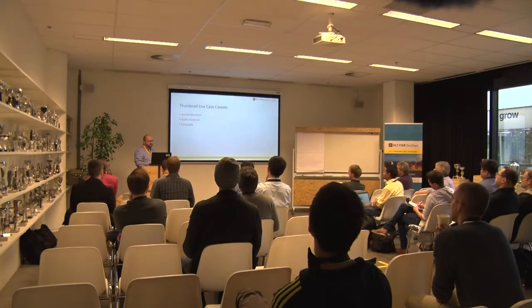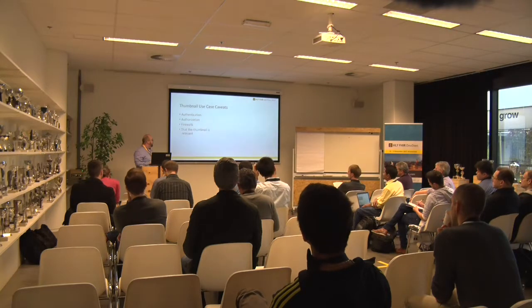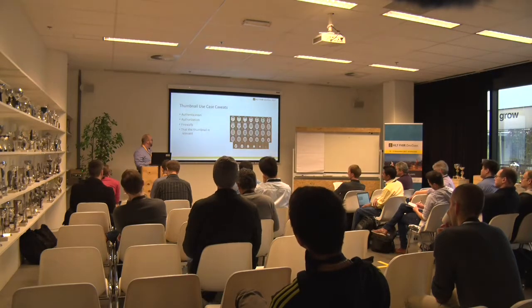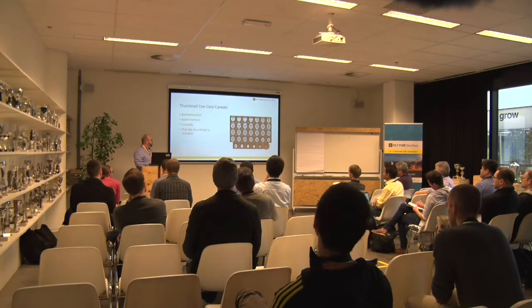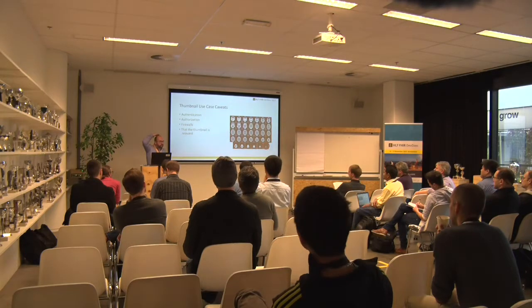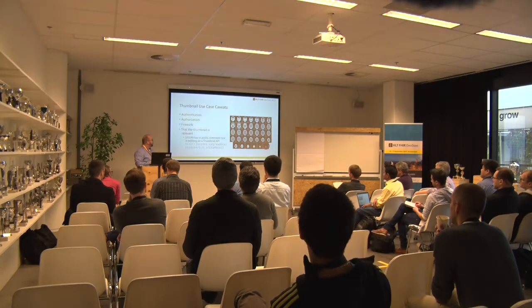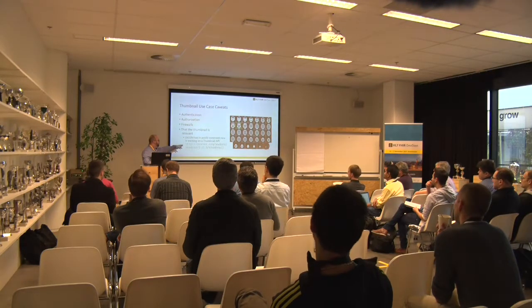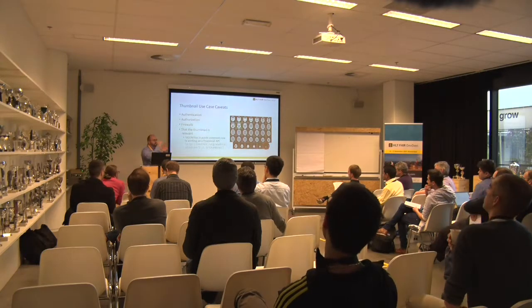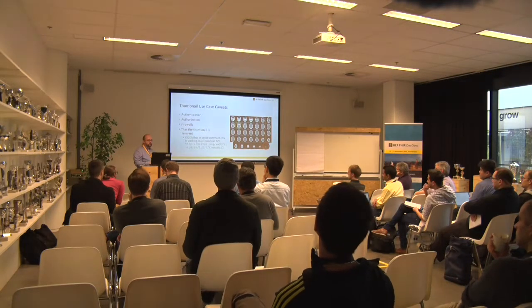There's lots of caveats though. Indeed in a basic use case, you have to think about security, obviously, and also that my thumbnail is relevant. So if you imagine you had a CT series here, if you grab the first image and it's of the guy's head, you're going to get the very, very top of the head, which is not very indicative for a clinician. They wouldn't like that. They would much rather see something like that. But in DICOM, we're working on a thumbnail API right now, where all you have to do is say the study/thumbnail, and it will give you a thumbnail that you can use to embed inside the EMR. It's almost part of the specification, but not yet.